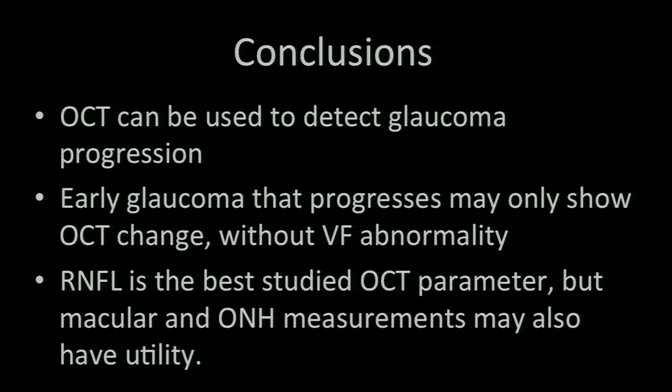So to conclude, OCT can be used to detect glaucoma progression. Early glaucoma that progresses may only show OCT damage without a visual field abnormality. The retinal nerve fiber layer is the best studied OCT parameter, but macular and optic nerve measurements may also have utility.